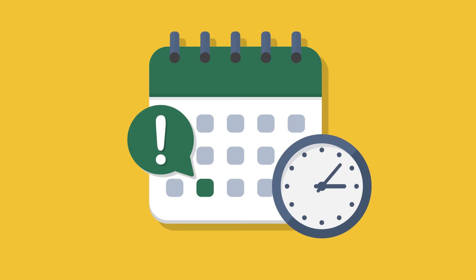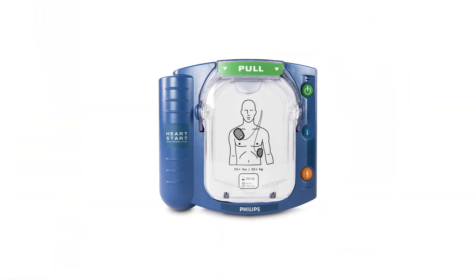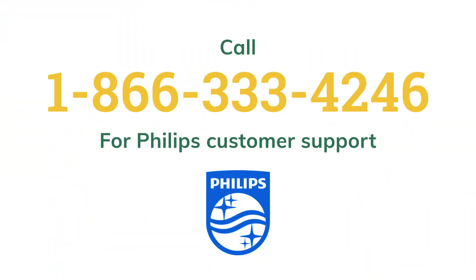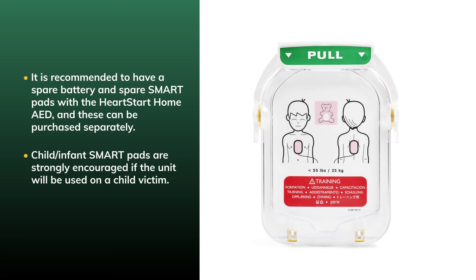You should always establish a schedule for performing periodic checks to the HeartStart Home AED. Don't store the device without a SmartPads cartridge installed. Make sure the green ready light is blinking, check any spare accessories for damage, and replace any that have expired. Inspect the body of the unit for cracks or damage, and if damage is present, contact Philips Technical Support for assistance. Record all maintenance checks in the included maintenance log. It is recommended to have a spare battery and spare SmartPads with the HeartStart Home AED. Child-infant SmartPads are strongly encouraged if the unit will be used on a child victim.